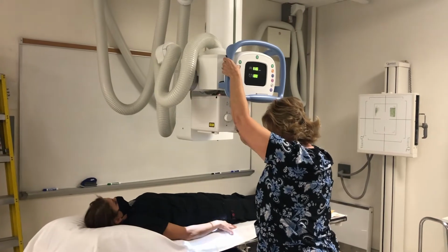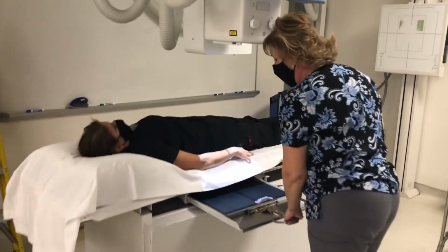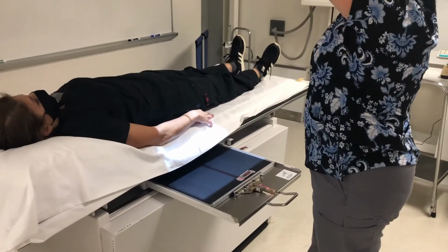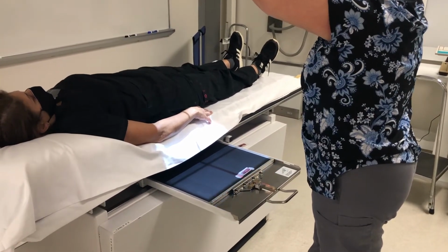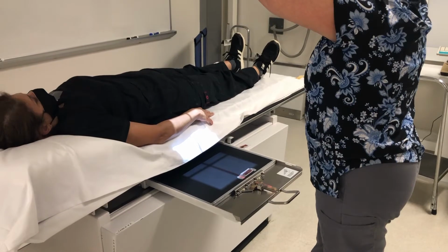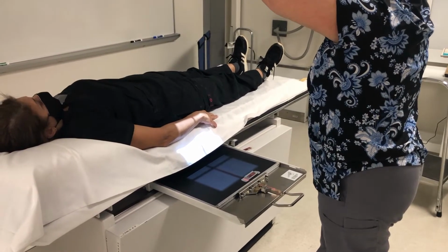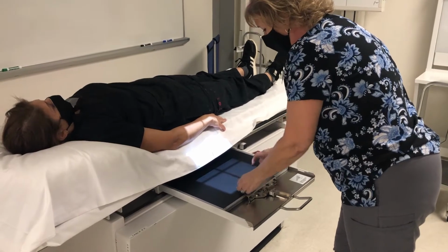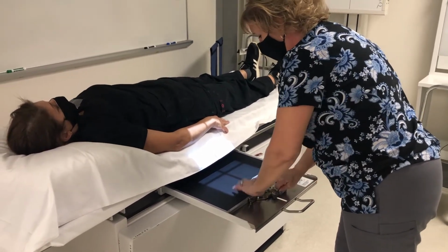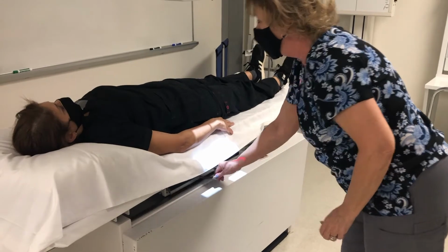And I would collimate it now down to 11x14 or 10x12, depending on the patient's size. So, looks about right. Make sure that your time marker is also in the field of view.